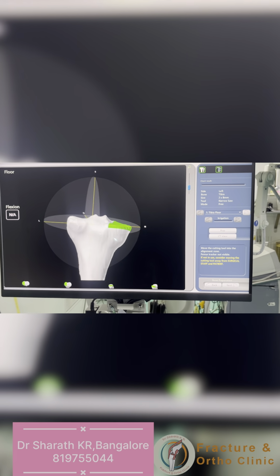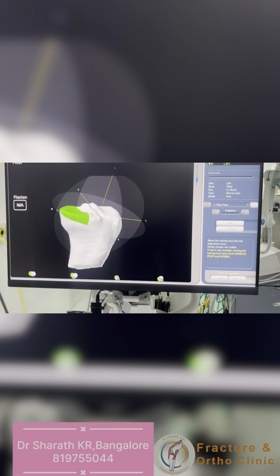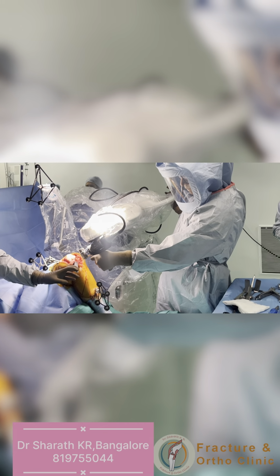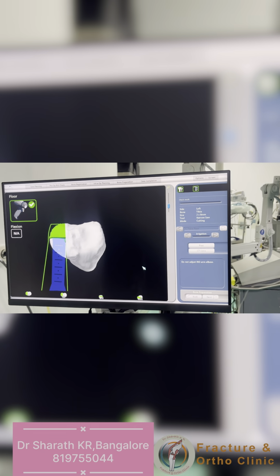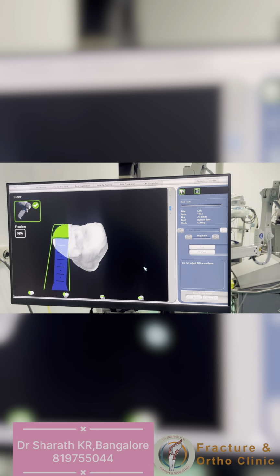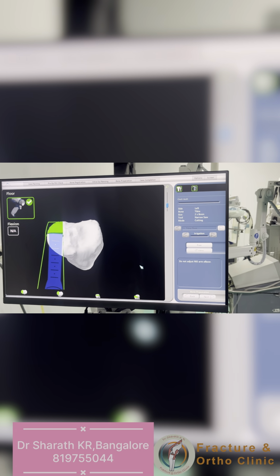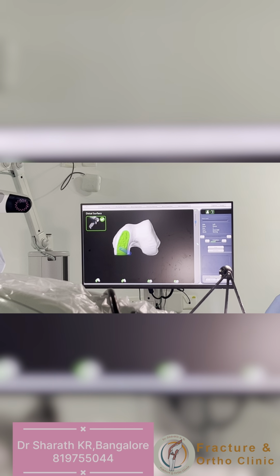Here we are doing the tibial resection. This is controlled by the haptic boundary. Tibial resection, the transverse resection of the tibial plateau bone, is done with the saw, and the vertical cut we sometimes used to do for partial knee with a reciprocating saw. Here we can use the burr instead of the reciprocating saw.